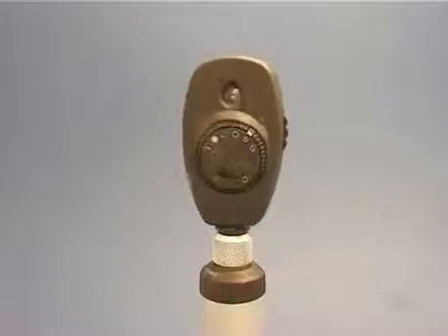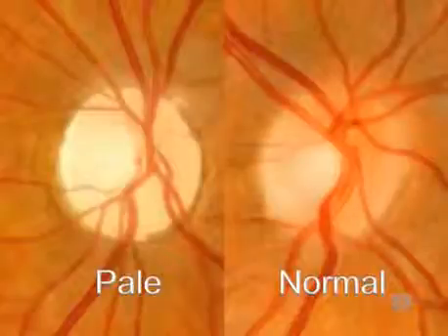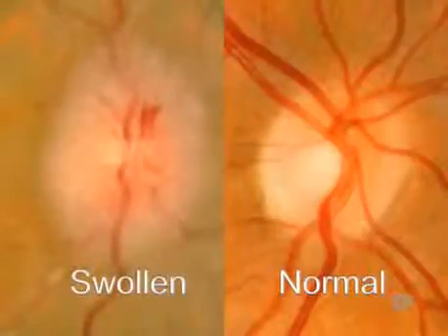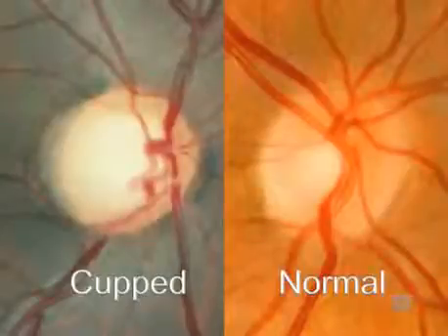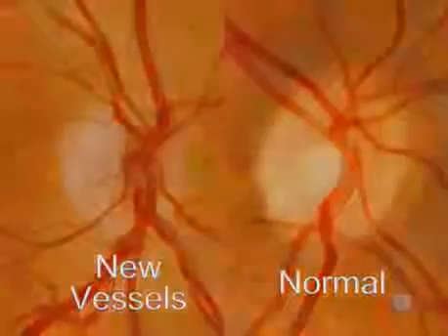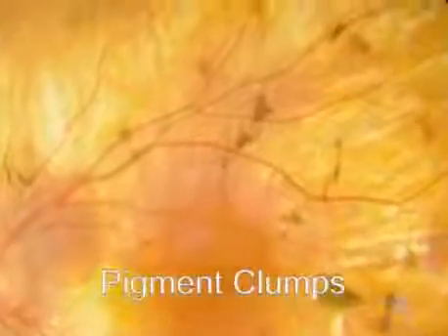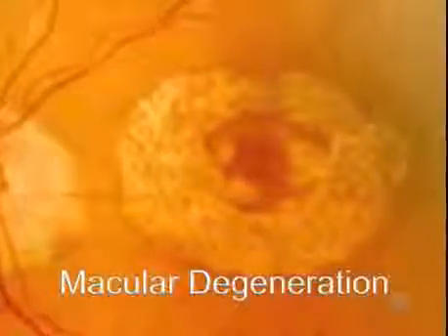That completes the basic tutorial on the use of the direct ophthalmoscope, but before we wrap up, we'll show you some pathology. Here's a pale atrophic disc that you often see in multiple sclerosis or following optic nerve trauma. This disc is swollen with a blurred margin — one important cause of this is raised intracranial pressure. Here's a disc with an enlarged cup, characteristic of advanced chronic glaucoma. You may also see new disc vessels in proliferative diabetic retinopathy. Aggregation of pigment granules in the peripheral retina is typical of retinitis pigmentosa. The central retina is the area affected by age-related macular degeneration, which is of increasing prevalence in our aging population.